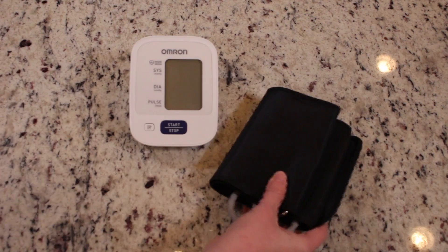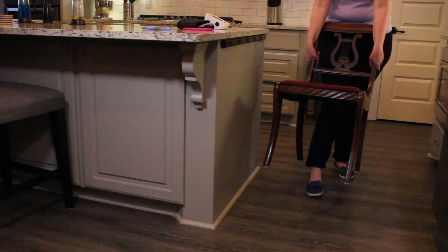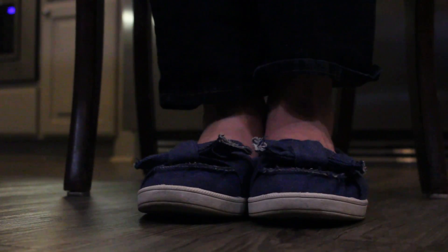First step, you'll need to gather your blood pressure machine and blood pressure diary and a pen. Place a chair next to a table or counter. Second step, sit with your legs uncrossed and your feet on the floor, and relax quietly for five to ten minutes.